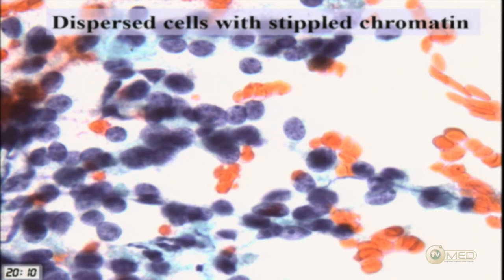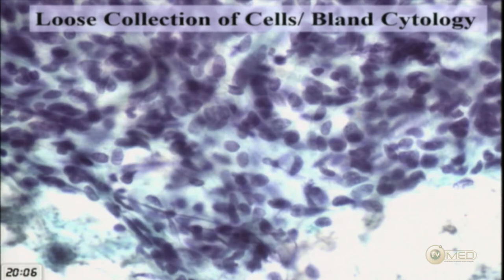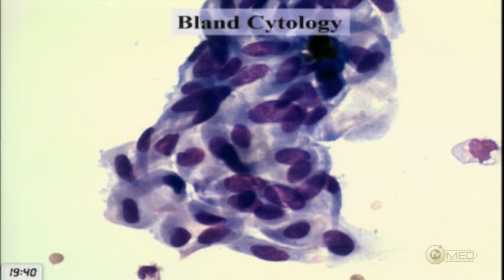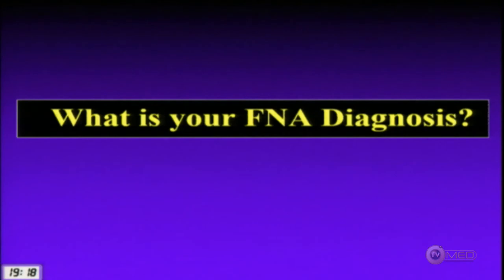Some cells have a plasma cytoid look to them. Another view shows the cells in a group without much atypia — no necrosis or mitotic activity. Nuclei are fairly uniform with smooth membranes and this really nice stippled chromatin pattern. At high magnification on liquid-based preparation, cells are very bland with an almost spindle-like pattern and a plasma cytoid shape with the eccentrically located nucleus.